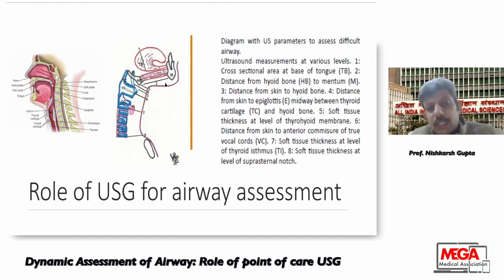And all of us know that if we have a very thick neck with fat, we may not be able to visualize these structures, or if this distance is increased, you expect a difficult airway. So this adds to the value of assessment, and the best part is that it is bedside and very dynamic. So it is very, very useful to plan things.